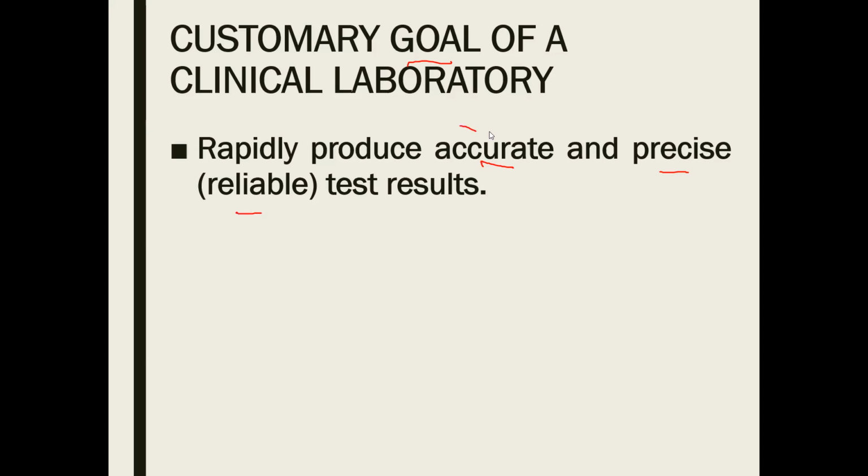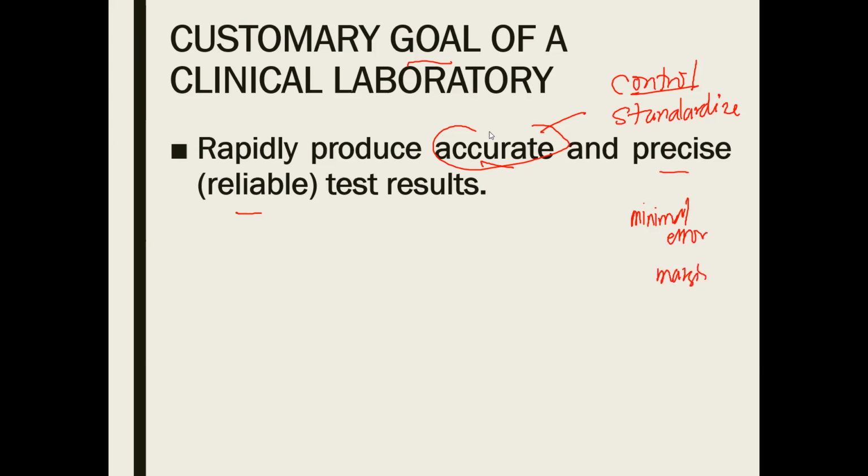Produce accurate because you are going to control, okay? You're going to standardize laboratory testing or laboratory analysis. What else? Precise. The measurement has only minimal error or minimal margin, no? If we are going to repeat the test, most especially if the sample that we are going to use does not have high amounts of our analyte.